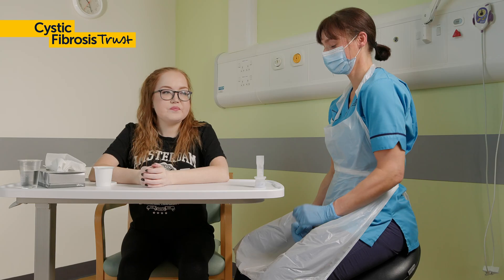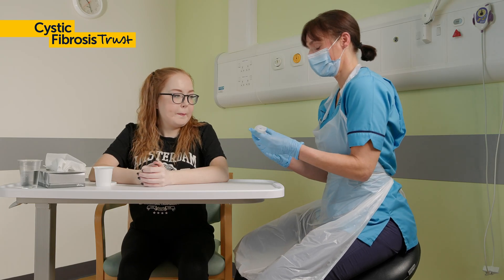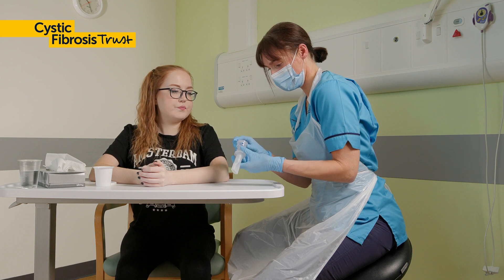The resistance is created by different size holes. You and your physiotherapist can decide which is right for you. Take any inhalers or nebulisers before your airway clearance techniques as you've been prescribed. You or your physio will set the resistance on the PEP device.